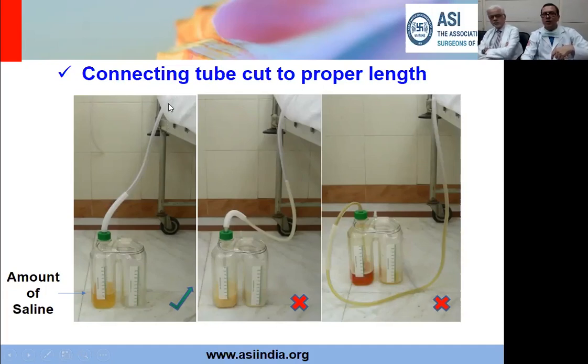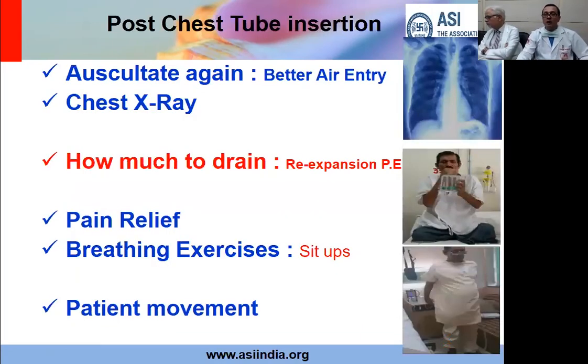Now, whatever fluid or air comes in this tube will go straight into the bottle. If you have a long loop or multiple loops, there will be more resistance to the flow of air or water, and it will not come out completely.